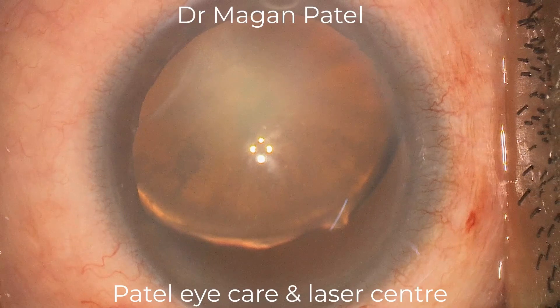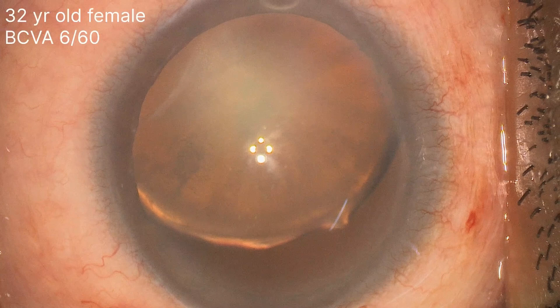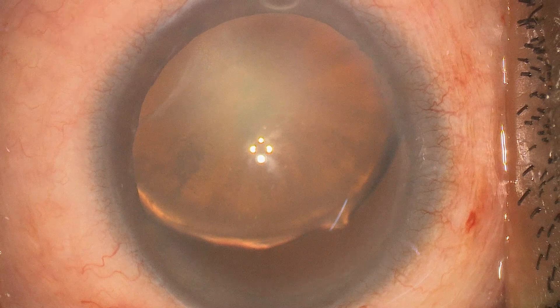Hello, this is Dr. Magan Patel from Patel Eye Care and Laser Centre, Bhuja. Today I'm here with a new beautiful case. A 32-year-old female who had a trauma three years ago, and presently the best corrective vision was 6/60. You can clearly see there were six clock hours of zonular dialysis, which was temporal. The beauty of this case was that the anterior hyaloid was intact, and there was Grade 2 nucleus sclerosis.